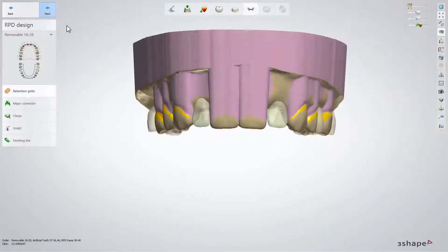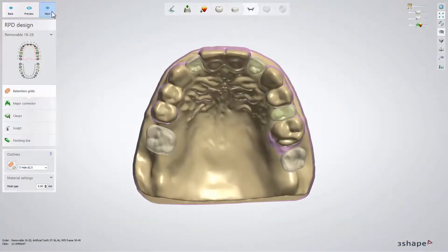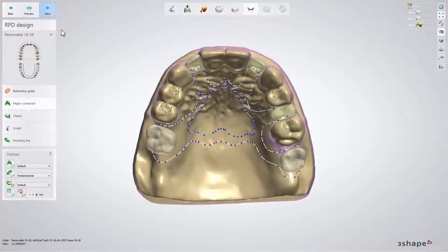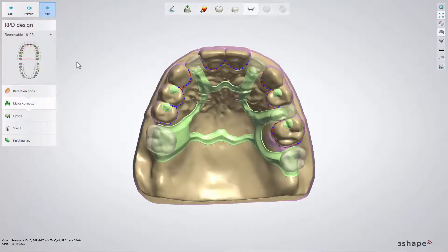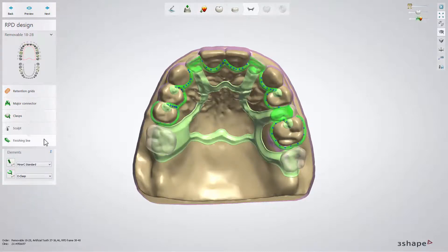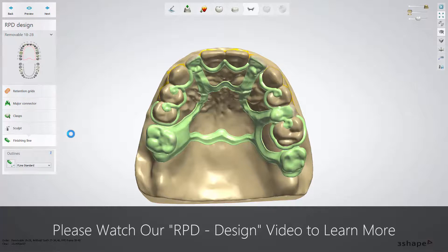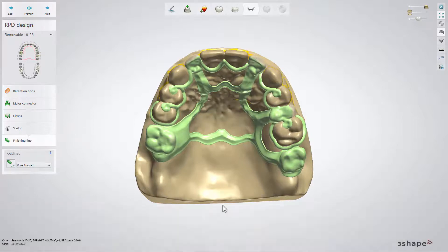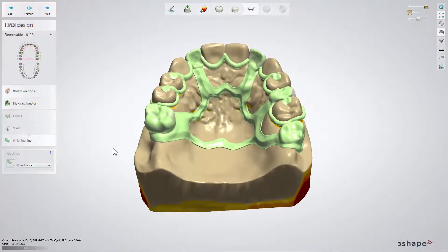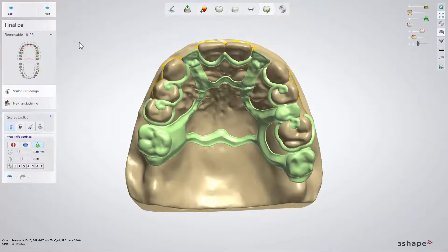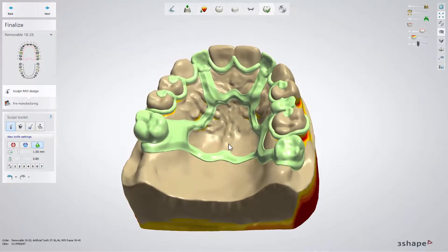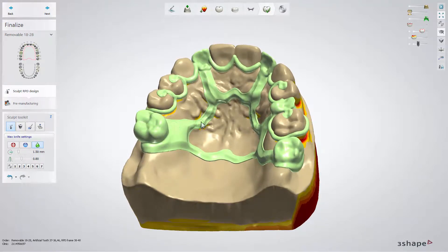Now it's time for RPD Frame Design. Here you create connectors, place clasps, add retention grids and whatever else is needed. The whole step was explained in our RPD Design video — by watching that, you can learn more. For the purposes of this video, we have created the design and will move to the finalized step. If you need to, you can use the available tools and sculpt the whole RPD structure, then move to the pre-manufacturing step.